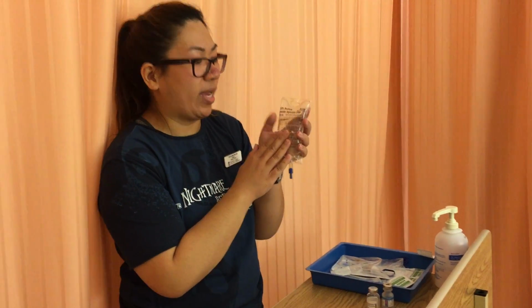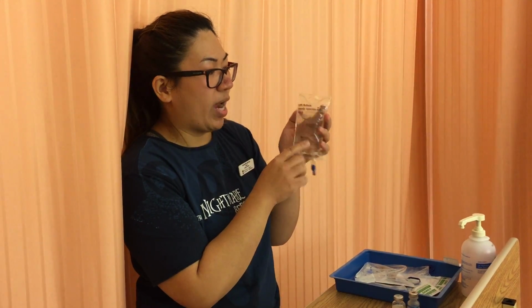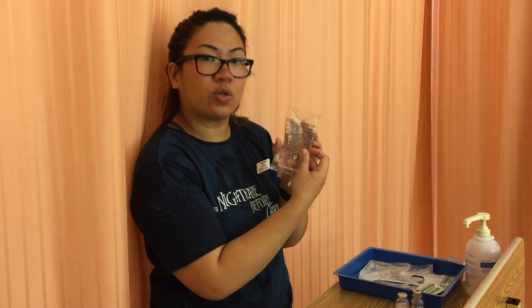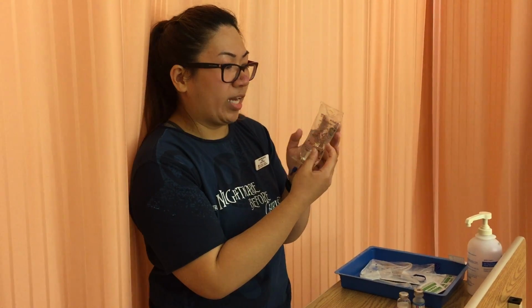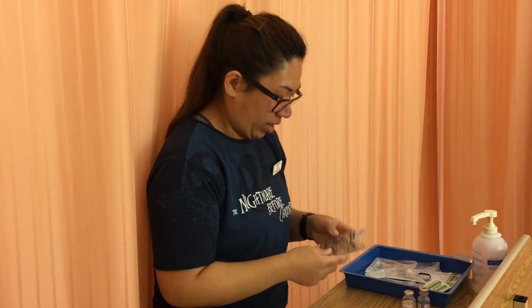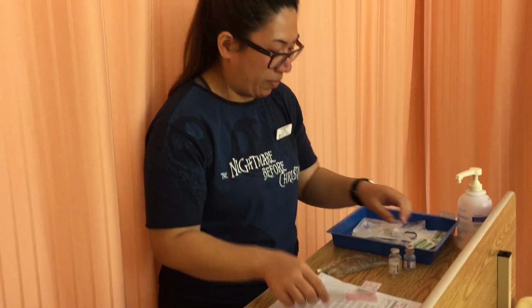Also, before using this bag, we want to make sure that we check the expiration date, that it is not expired. We look at the consistency of the solution, if it's clear and there's no crystallizations, to avoid any issues. Alright, and this is clear. Now we're ready to put our medication.